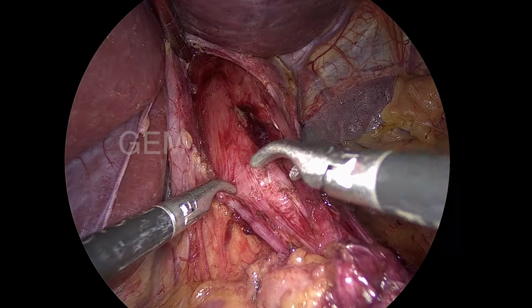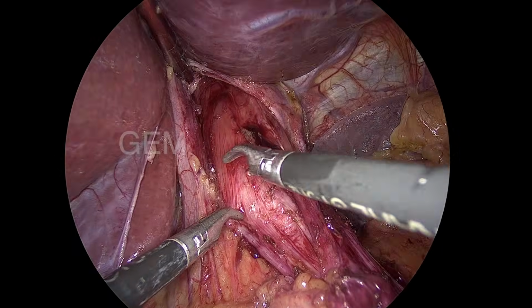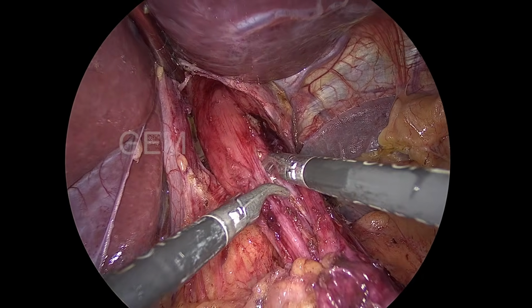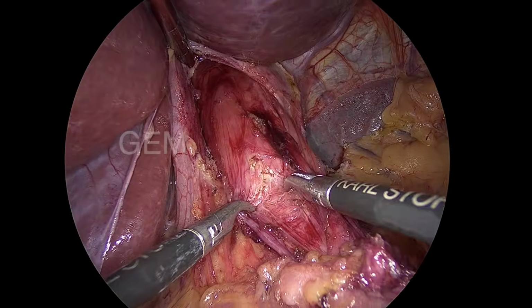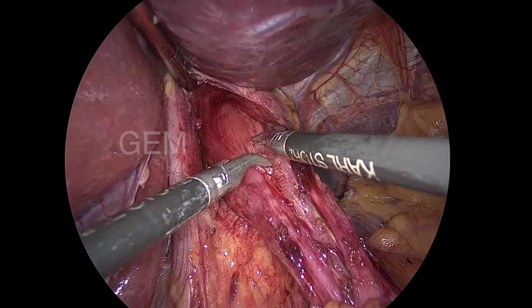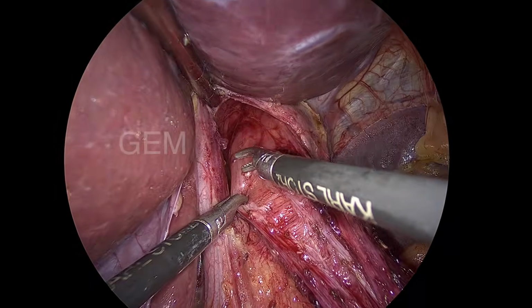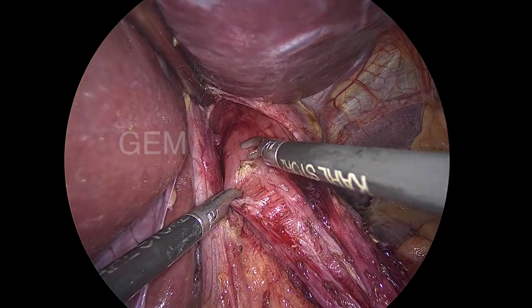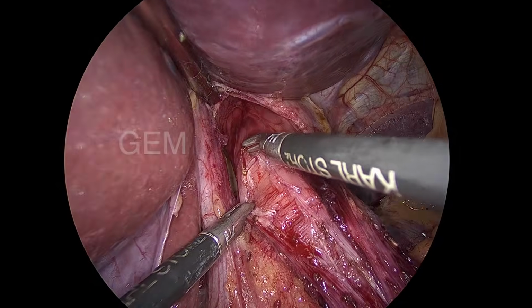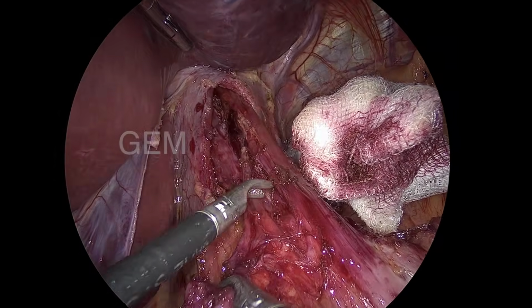Initially, the first step is to apply minimal cautery and then separation of the longitudinal muscle, because a lot of blood supply is there only on the longitudinal, not on the circular muscle. So I am separating the longitudinal muscle with minimal cautery. You can see up to what level you want, I am separating the muscle. I am not concentrating on the circular muscle dissection or division. I am going to that only second. So I want to go to that level.